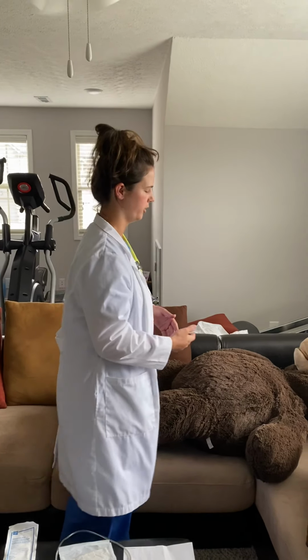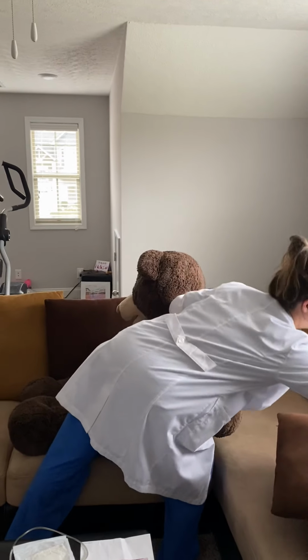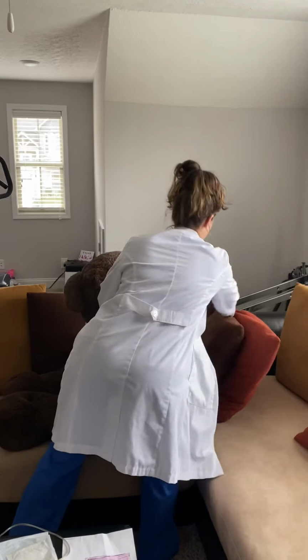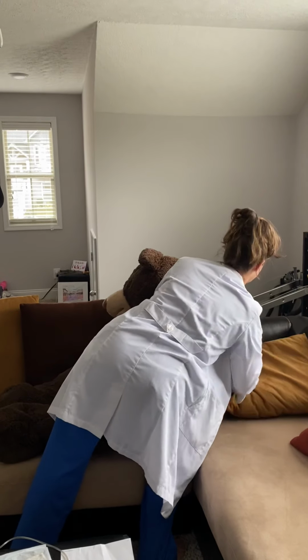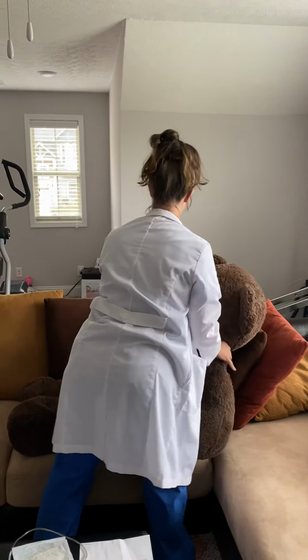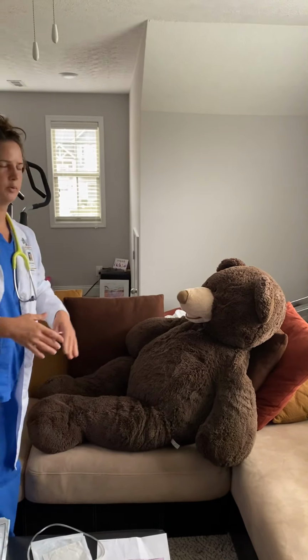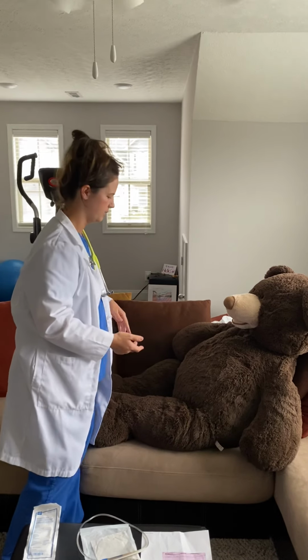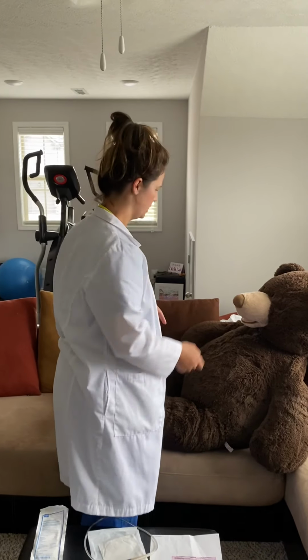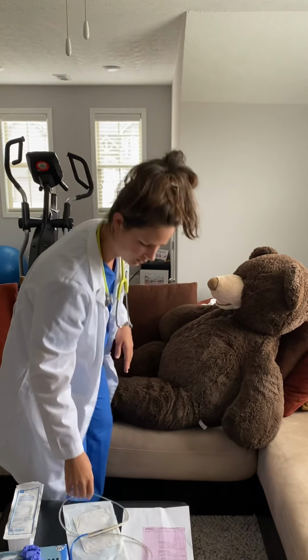And now for the procedure, you want to make sure that they're in Fowler's, or high Fowler's is preferred if tolerated. I'm going to put Mr. Gastritis back up here. Make sure that he's comfortable and just go over the steps with him. Make sure he knows what you're doing at all times. And so I already looked up the nares, and we're going to go with this left nostril here.